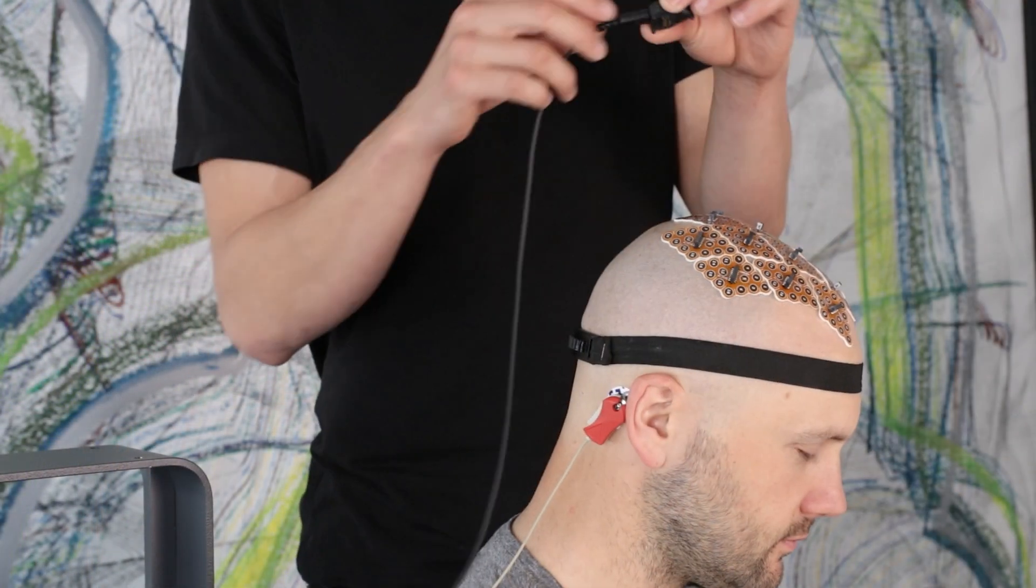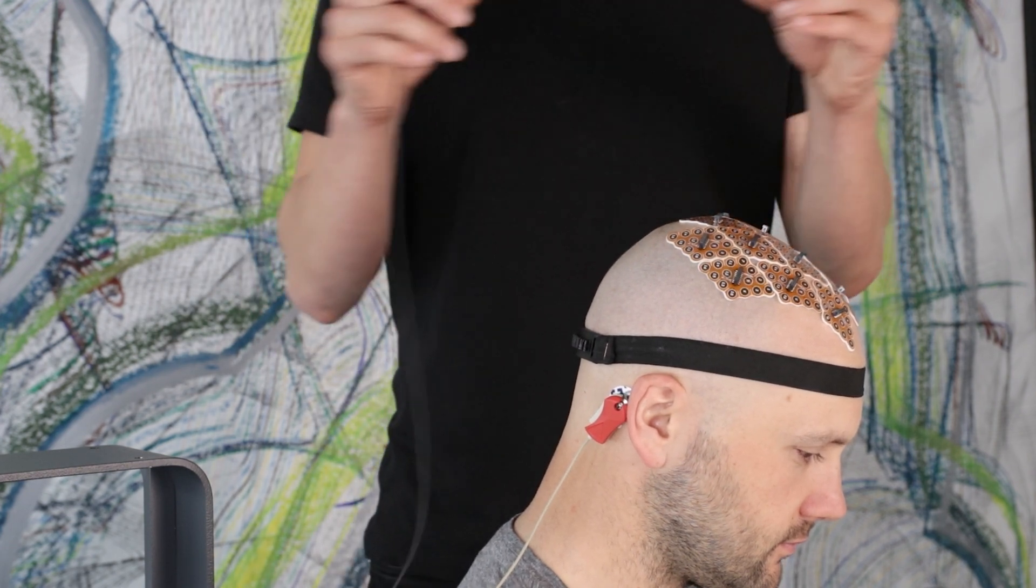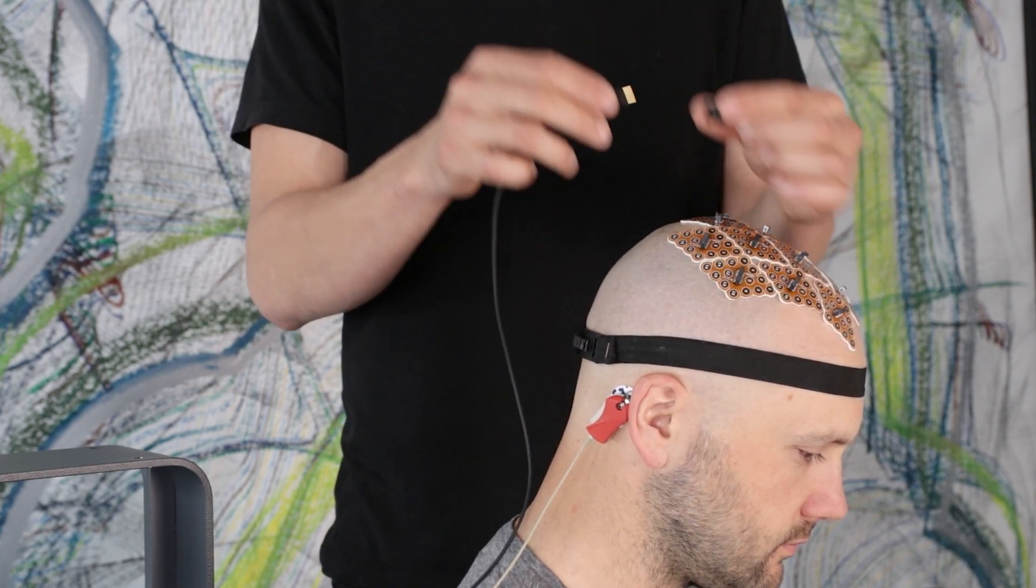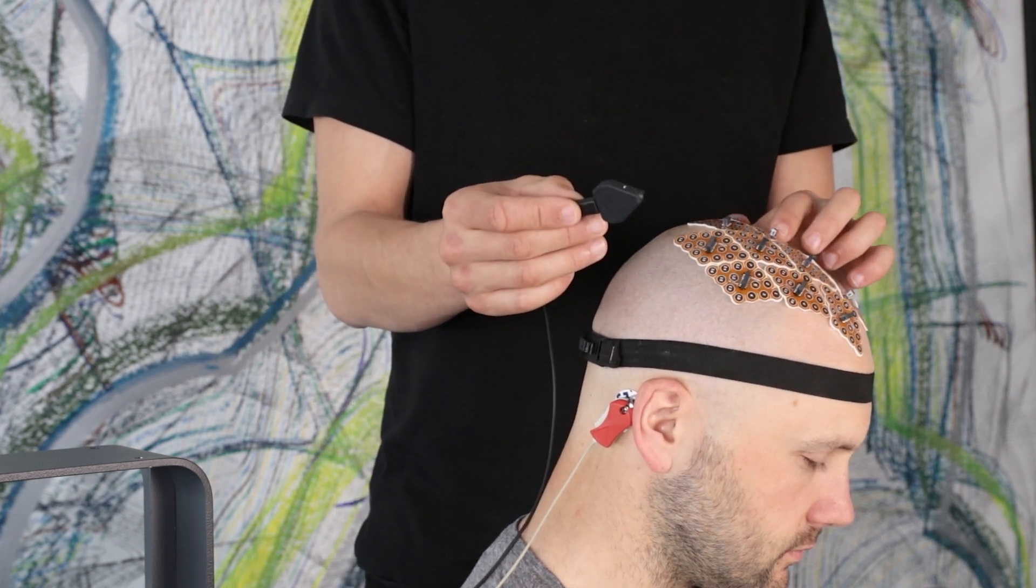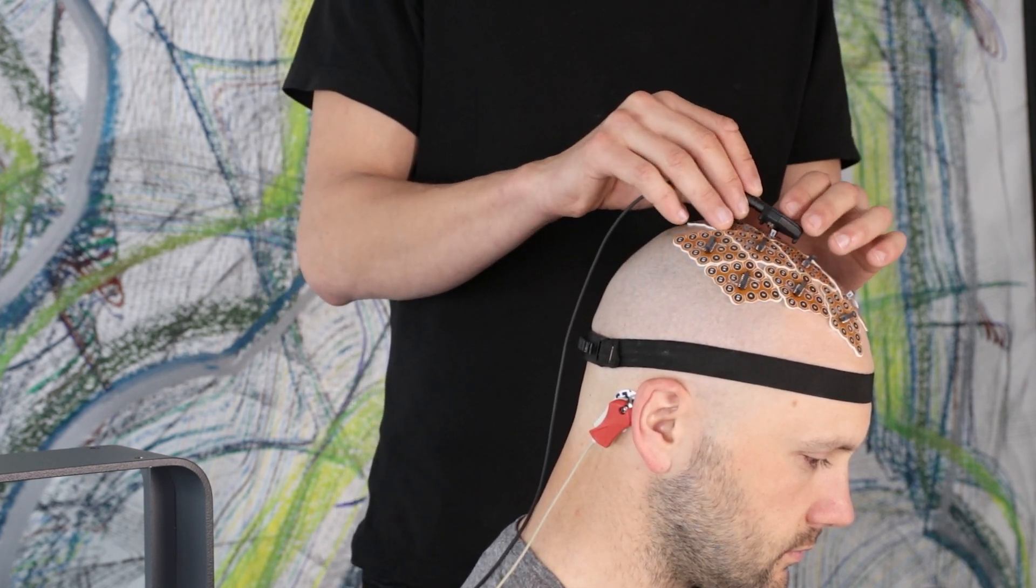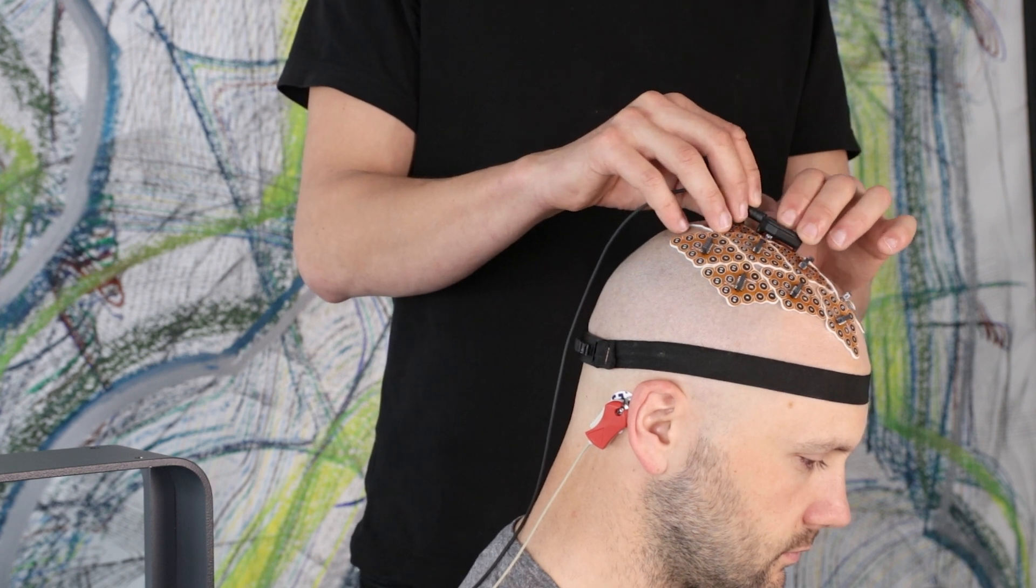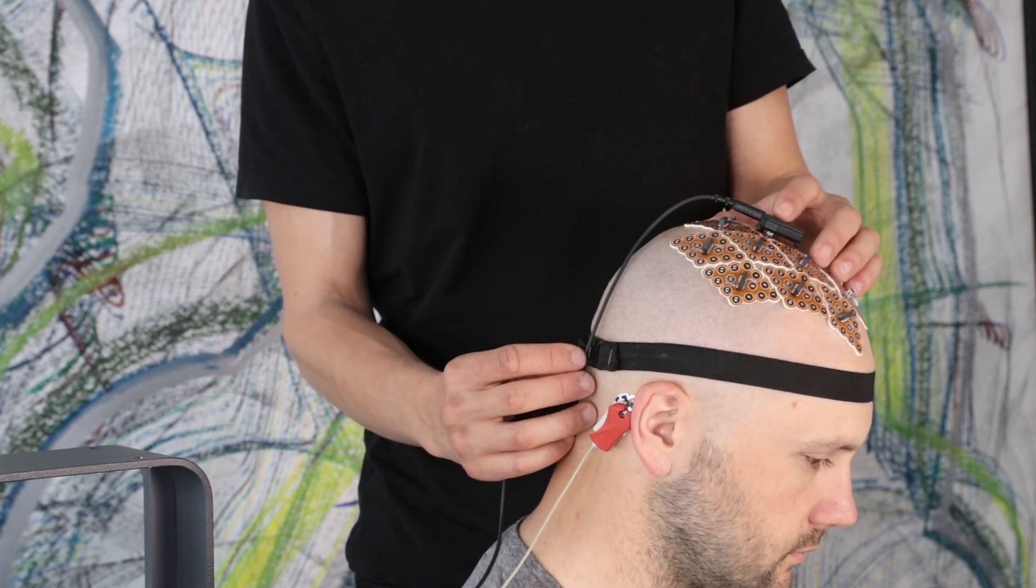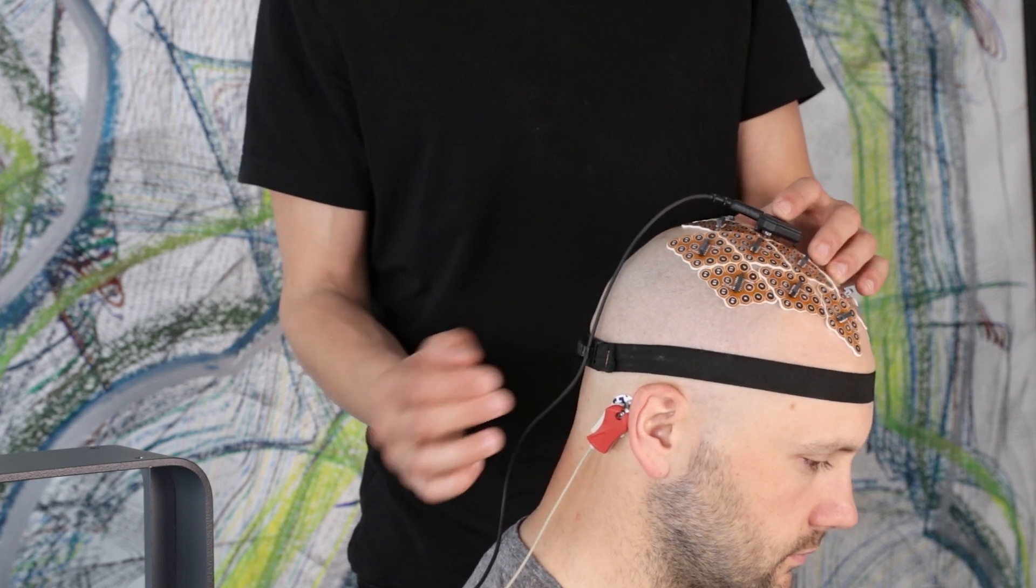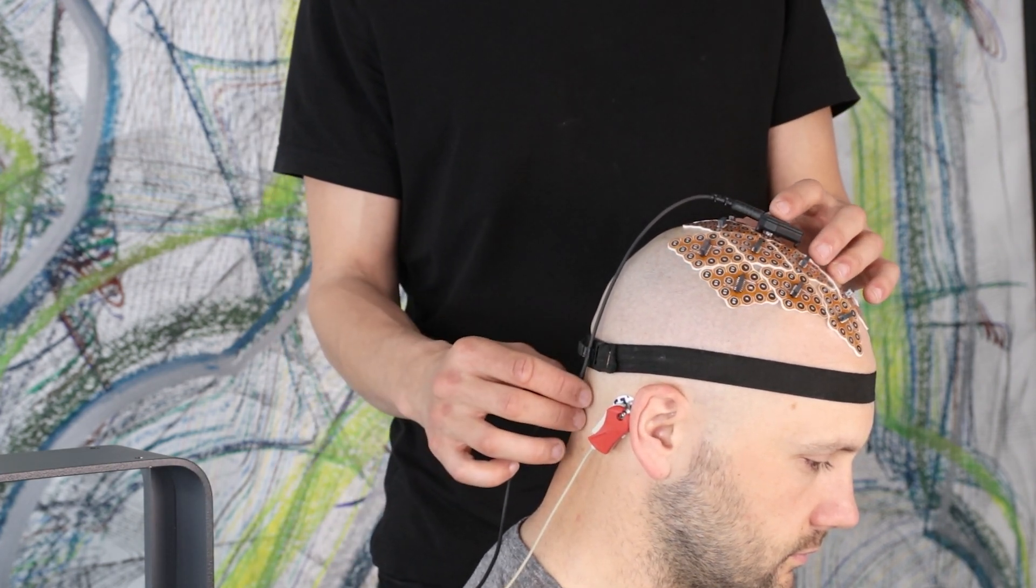As a next step connect the pre-amplifier with the HDMI cable and plug it onto the electric grid. Afterwards, you can lay down the cable and connect it to the cable holder on the backside of the head so the cable is not moving.